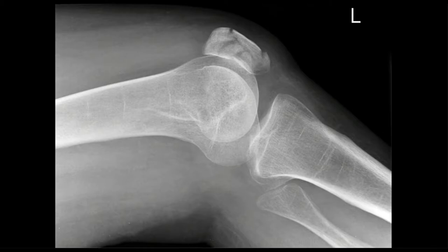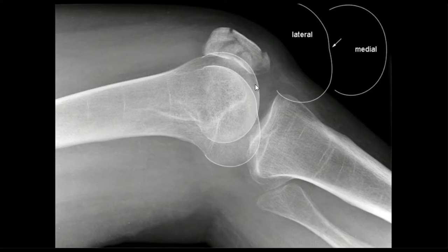I got some of these images from wiki radiography — full disclosure, this is where I learned this little trick. I've been using it for years and it's served me well, especially when the other indicators for lateral knee were difficult to see, such as the fibula either being superimposed or not superimposed, and also the adductor tubercle, which isn't always easy to see. So what we're going over is the lateral notch. You can see the lines drawn around the condyles — the medial condyle is a lot more round, the lateral side tends to be flatter and has this notch.